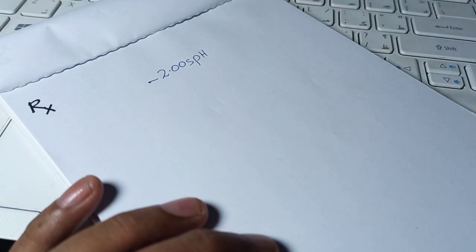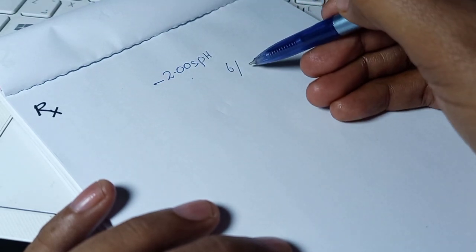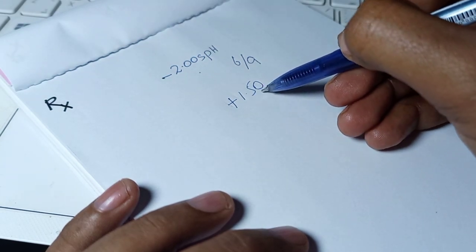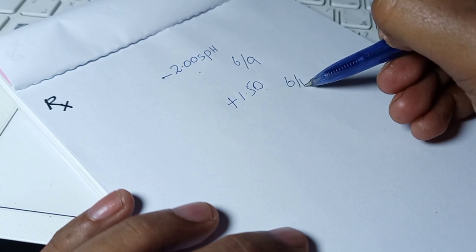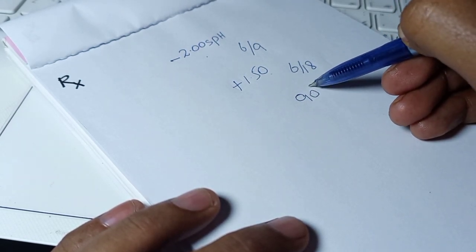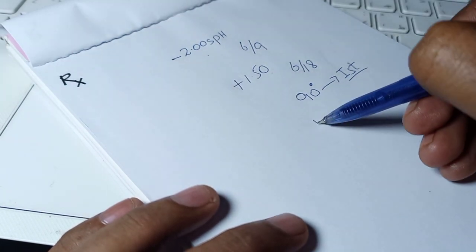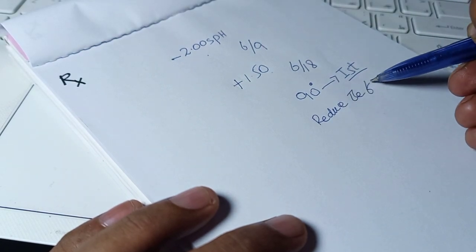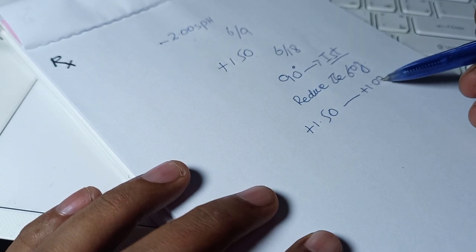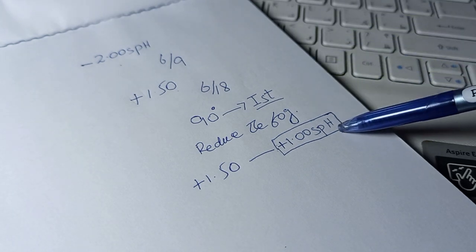Now let us review the written explanation. The best vision sphere of our patient was minus 2 spherical, and the visual acuity with the best vision sphere was 6 by 9. We then added a fogging lens of plus 1.50, which reduced visual acuity to 6 by 18. The axis of the stenopic slit was 90 degrees — our first principal meridian. We then reduced the fog from plus 1.50 to plus 1.00 spherical. So at the first principal meridian, our residual fog was plus 1.00.